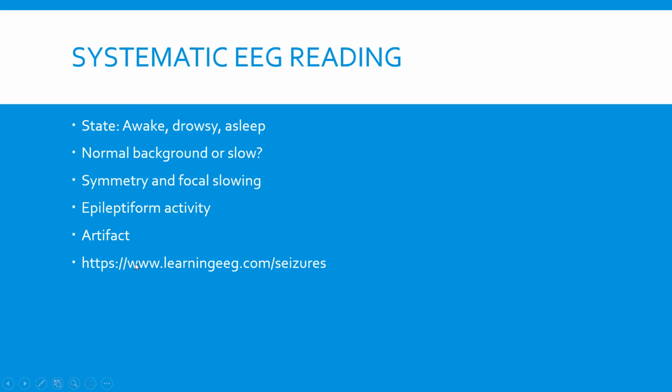And I have to give credit. There's a website called www.learningeeg.com. I took some of their slides. I feel guilty, but I definitely want to give them some credit for having some great examples of how to read EEGs.